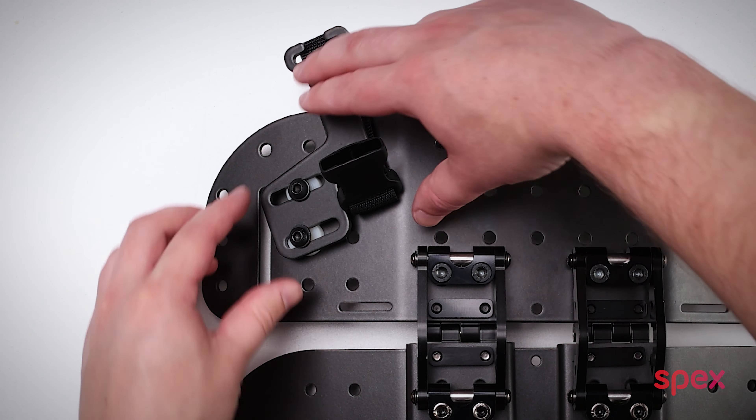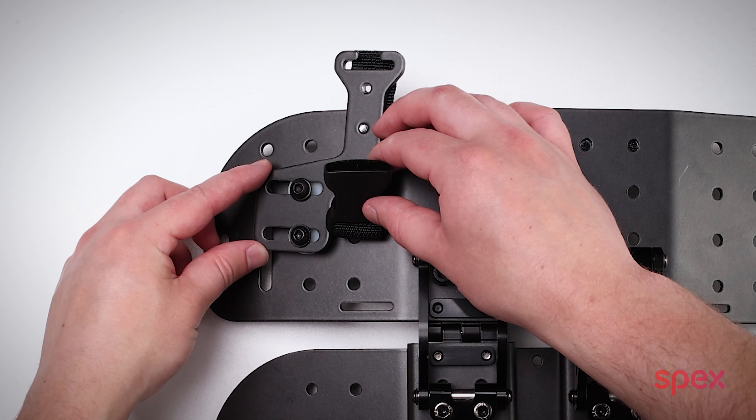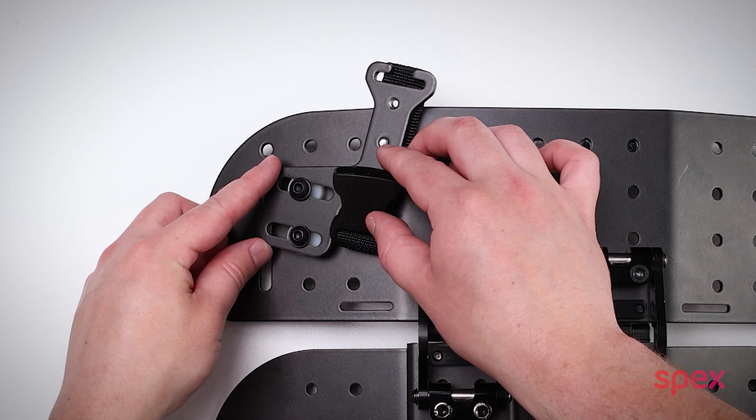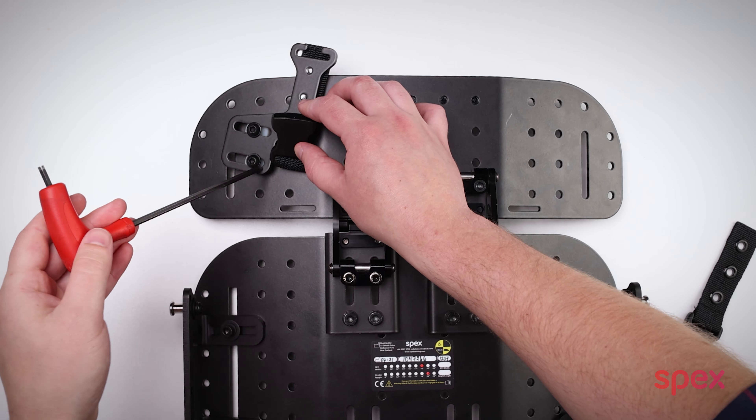With the guide now mounted loosely and able to be moved around, move this to the optimal position that suits the user — from side to side or even slightly angled like so. Now tighten the screws with a four millimeter allen key.